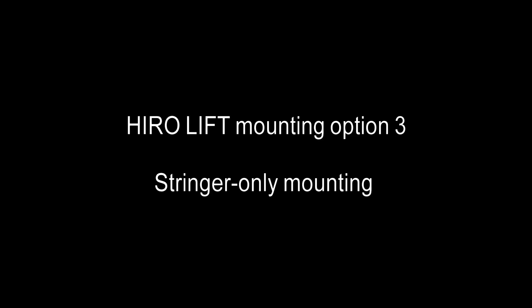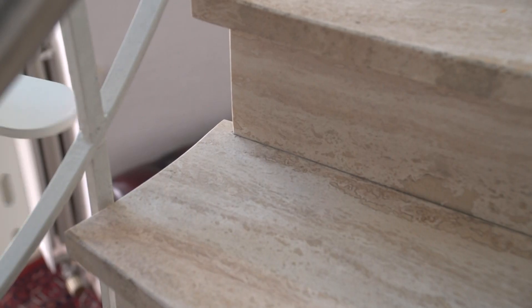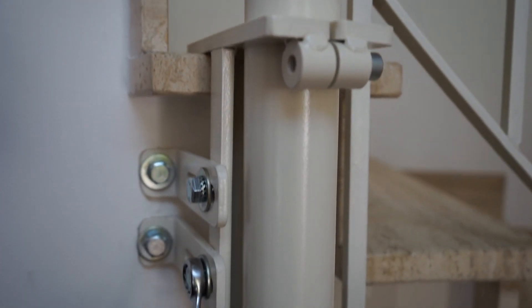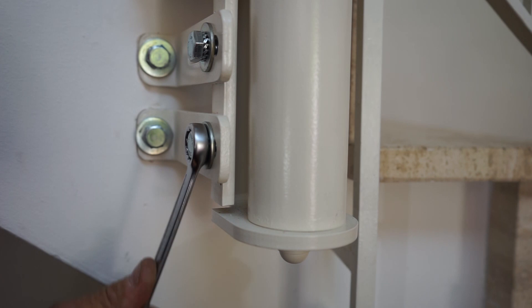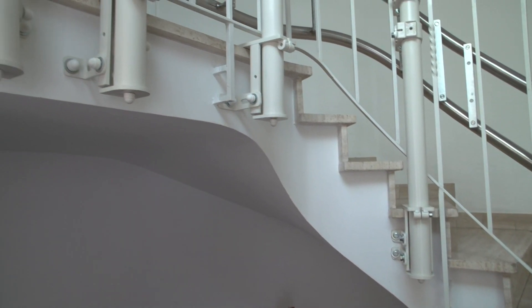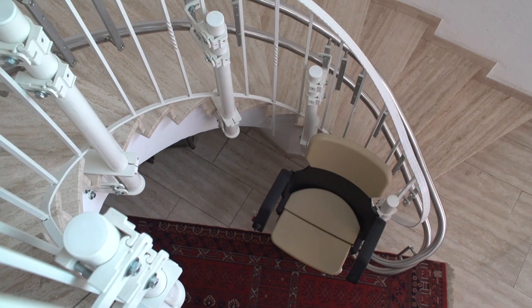Hero Lift mounting option three: stringer only mounting. In this case, the guide rail supports are only secured to the sides of the steps. In case of removal, the drill holes in the stringer are much easier to cover up than drill holes in the steps of the stairs.